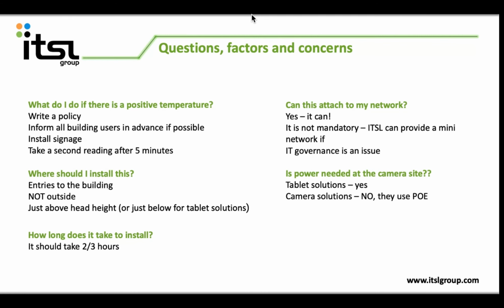I did mention this earlier. So infrared technology, obviously, is affected by sunlight. So they're not accurate if they're placed in an outside environment. I did mention that we've come up with different ways of dealing with this. We have been working with a construction site to set up, if you imagine containers, like the big shipping containers, a door open at each end, building a little sort of reception cabin in there, placing a camera within that environment so you walk in, be scanned through the tunnel, back out the other side, and a cubicle for a receptionist or a security officer to make sure that somebody doesn't continue if they're over temperature.